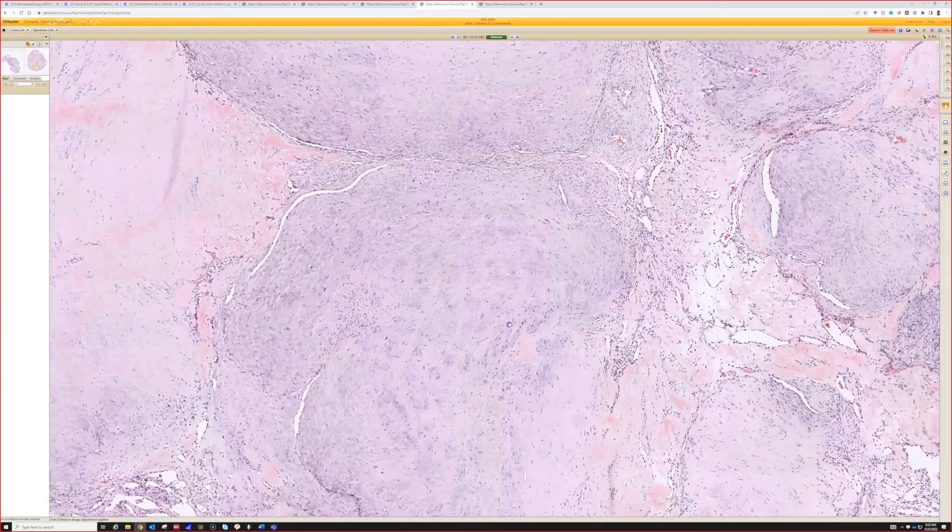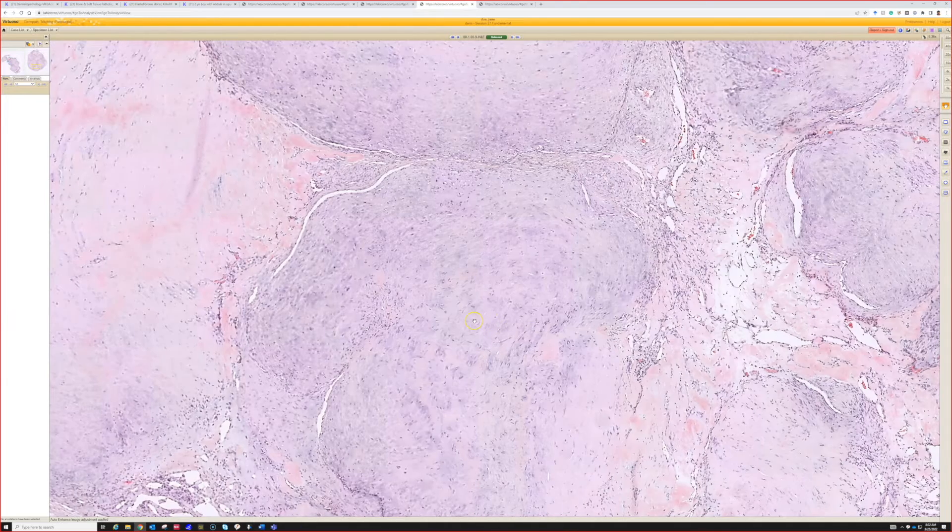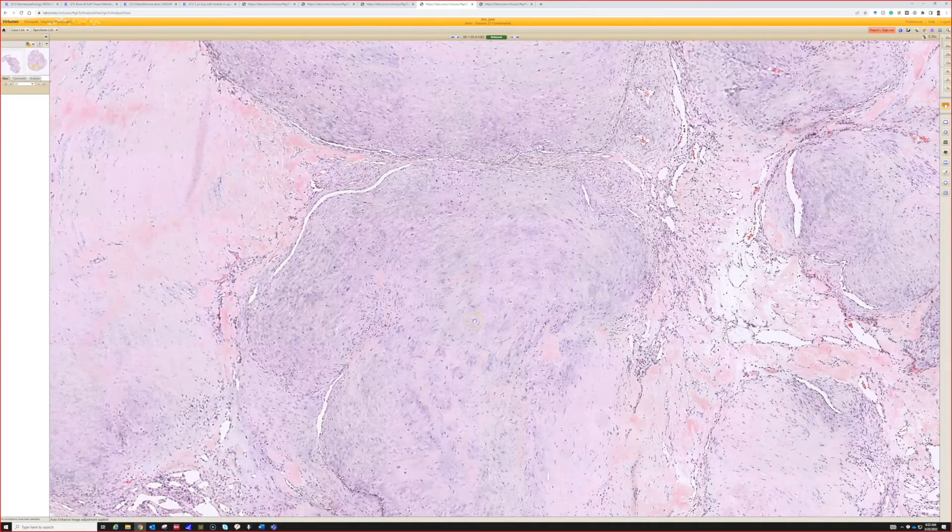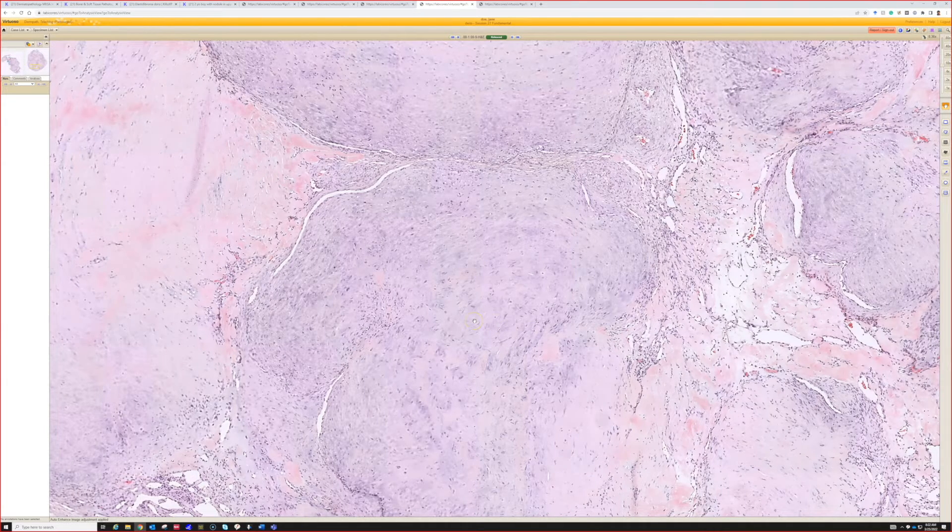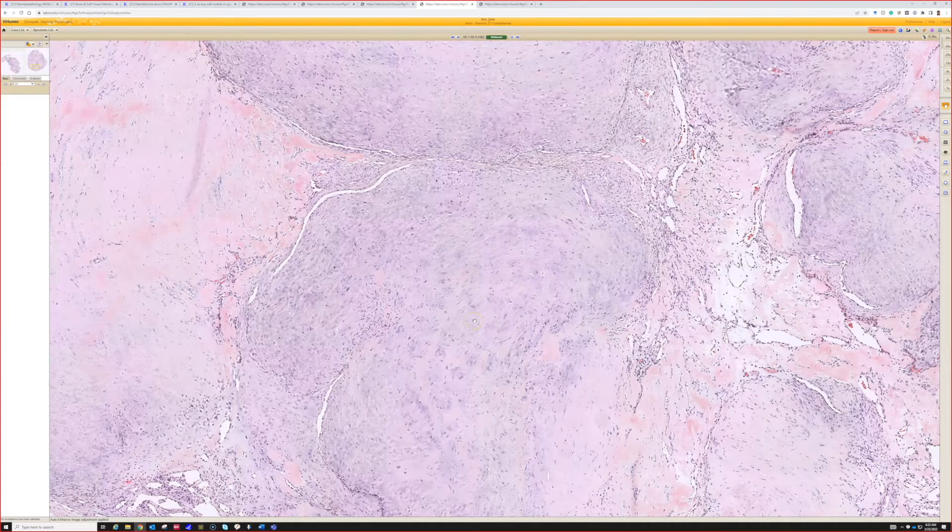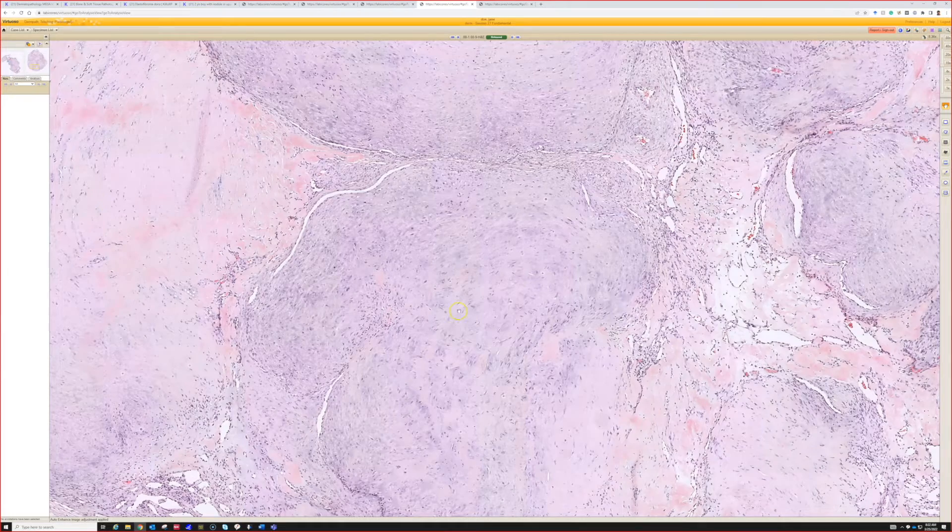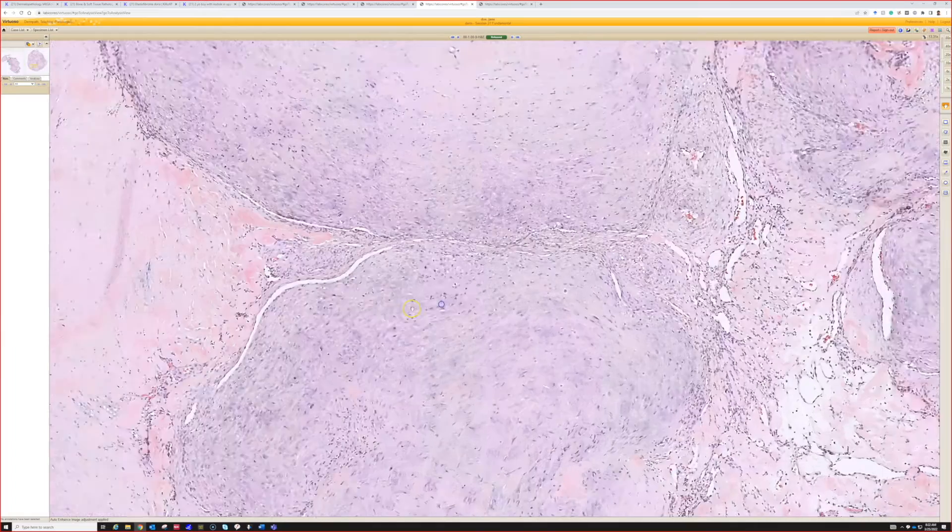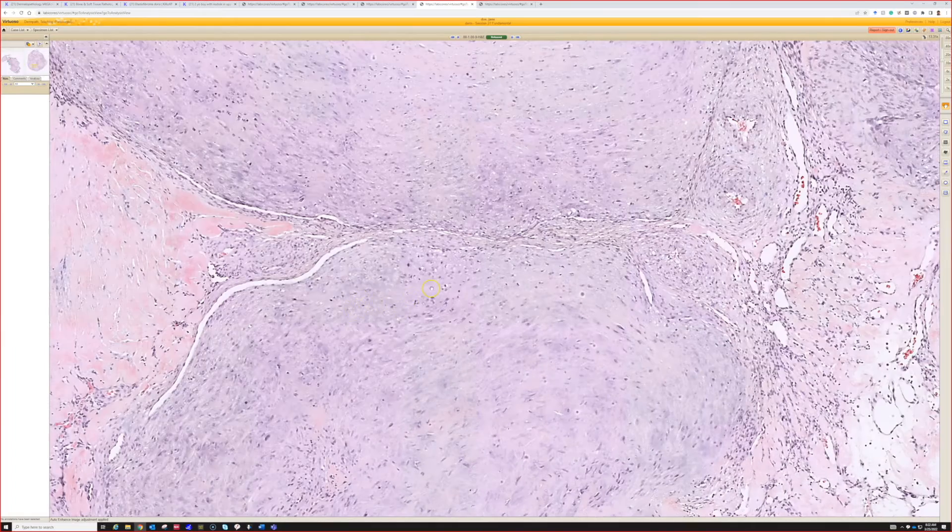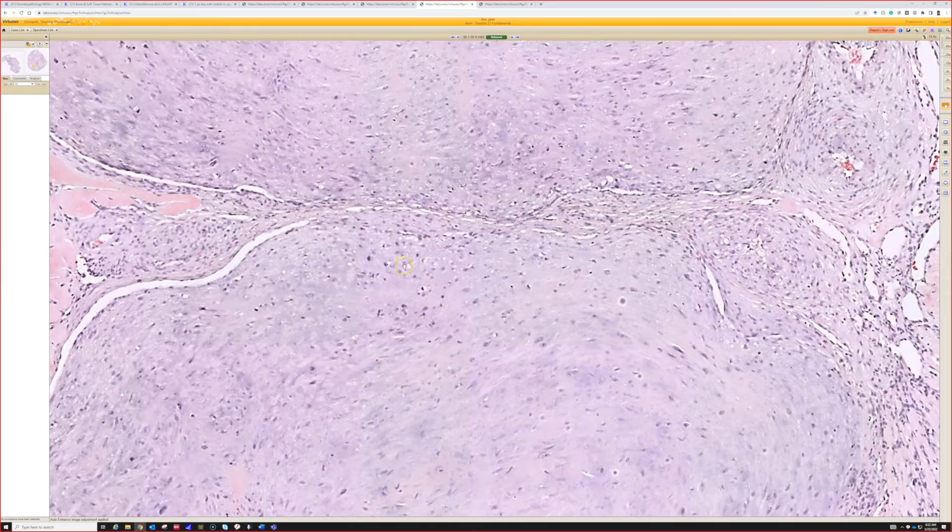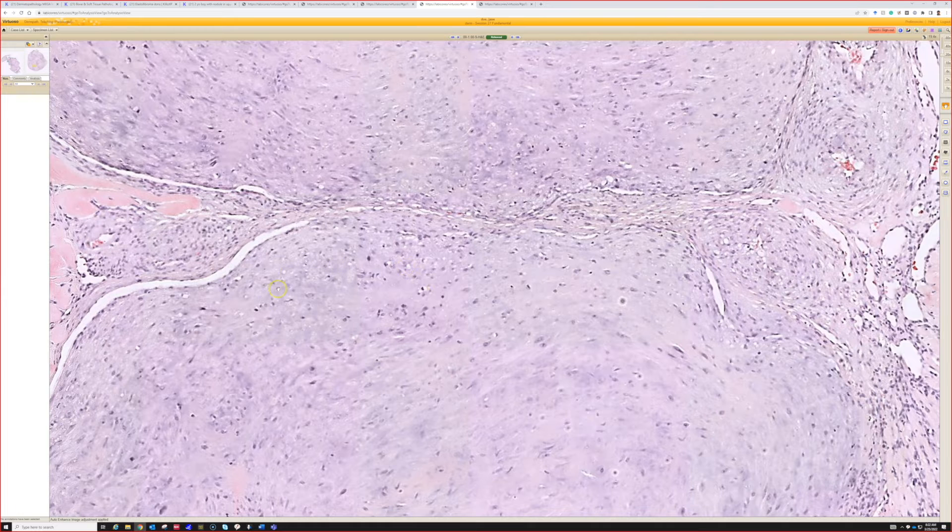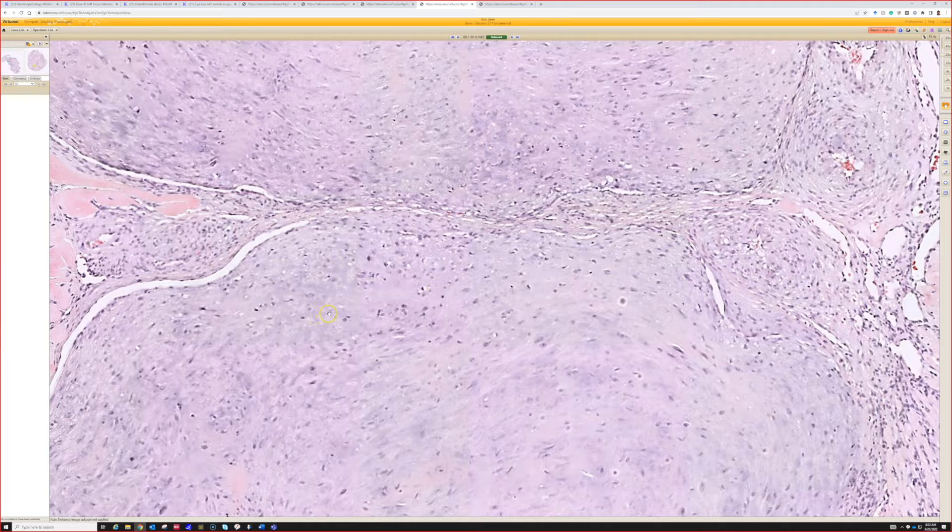In fact, the bluish color is very common in these, and to my eye it looks kind of chondroid. It gives you that kind of chondromyxoid look, and sometimes the cells almost look like they're in little tiny lacunar spaces.